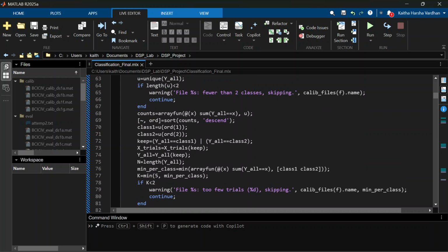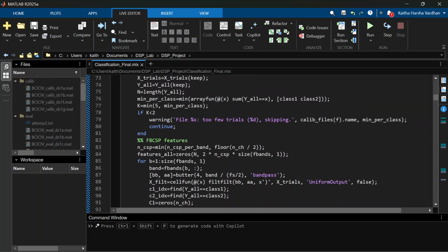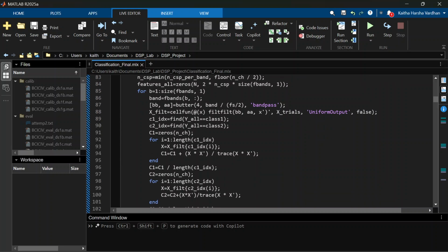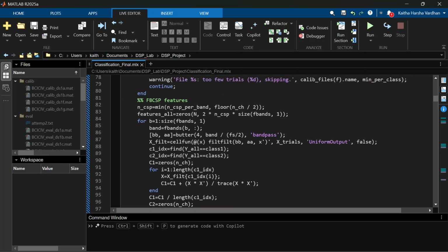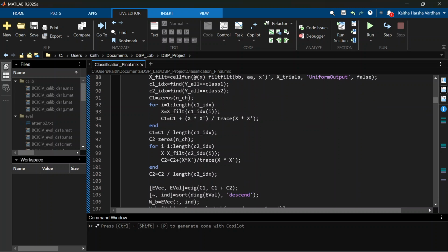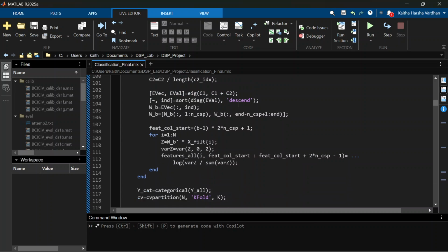Next, we sort the data set, and then comes the FBCSP part. Basically, first we normalize and find the covariance. Covariance is almost similar to power. Here we find the covariance for both the channels, and then we give it to the eigenvalue problem and try to get the solutions for it. We can use the inbuilt function.